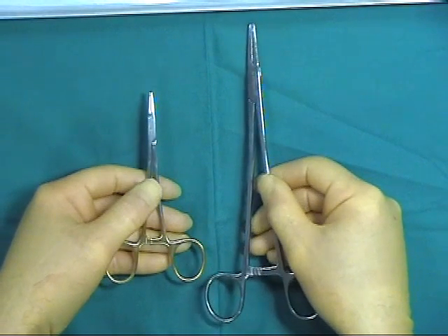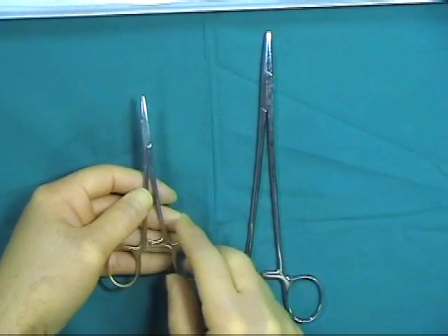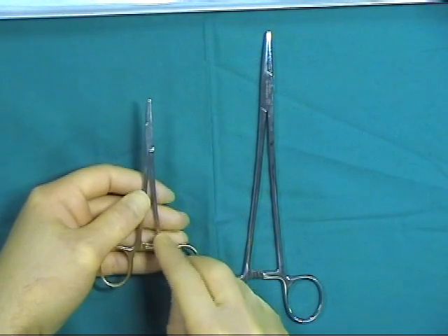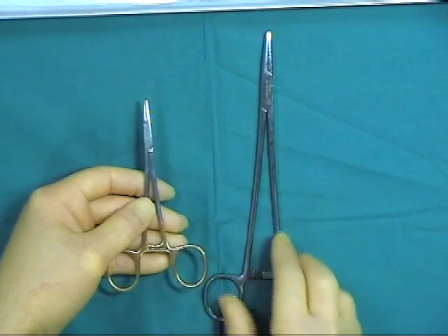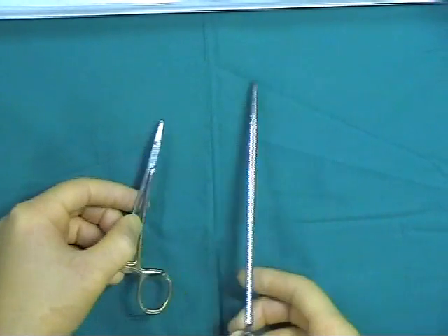Here we have two types of needle holders. One is a smaller, gold-tipped needle holder for finer work. The larger needle holder is for use with larger needles, such as those used in closure of the abdomen.